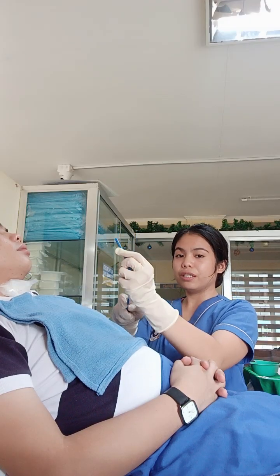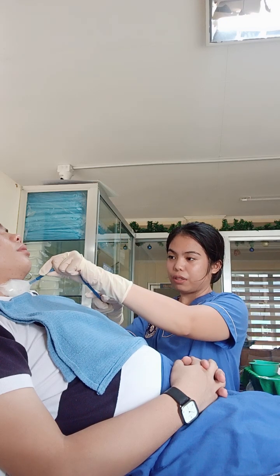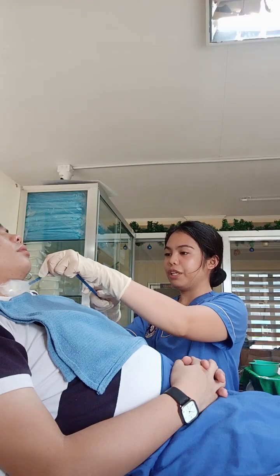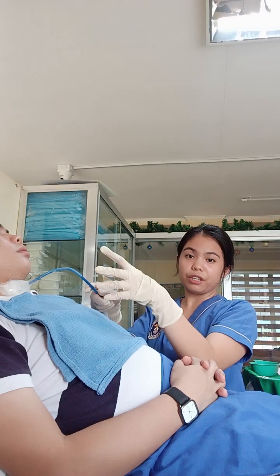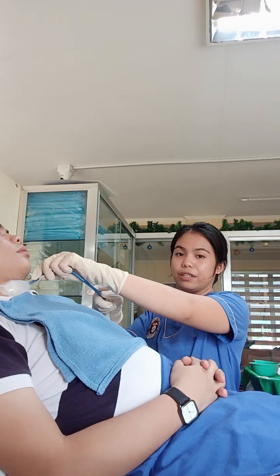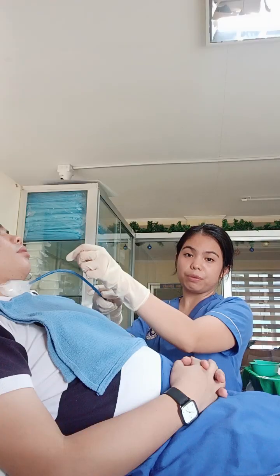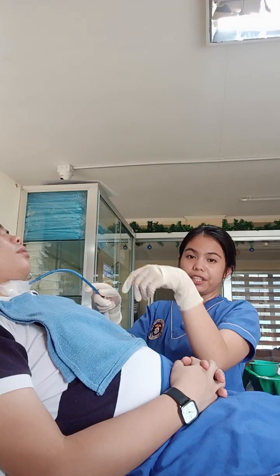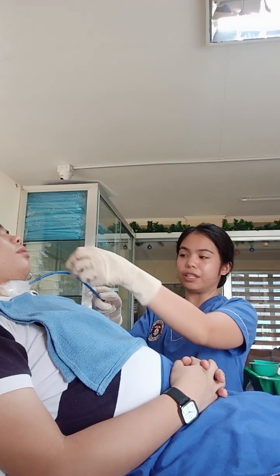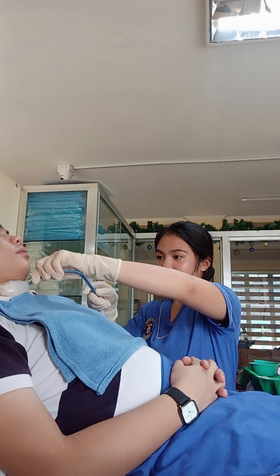So after hyperoxygenating the client, we now slowly but gently, along with the curvature, rather, quickly, insert the suction catheter tube, making sure that we only keep it inside for around 10 seconds and remove it. When we put it inside, we make sure that there's no pressure yet, and then when we remove it in a rotating manner, we apply pressure intermittently. So again, quickly but gently, and then remove in a rotating manner with intermittent pressure.